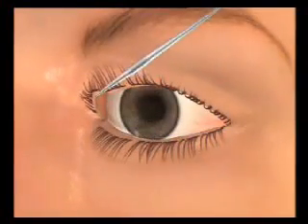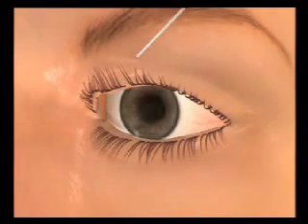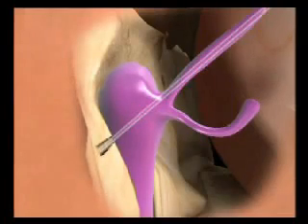The upper lacrimal punctum is then dilated and an optical fiber is inserted and advanced along the anatomical pathways through the superior canaliculus, common canaliculus, and lacrimal sac, entering into contact with the medial wall of the lacrimal sac, confirmed by the hard boundary of the lacrimal bone. Laser energy is then delivered in pulses until the fiber passes to the nasal fossa.